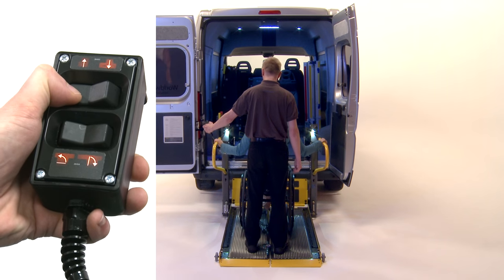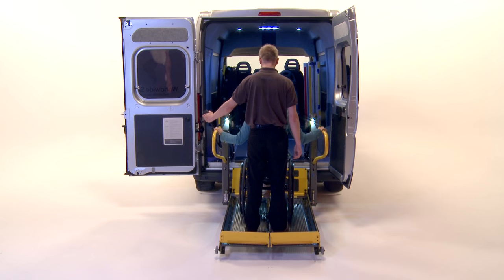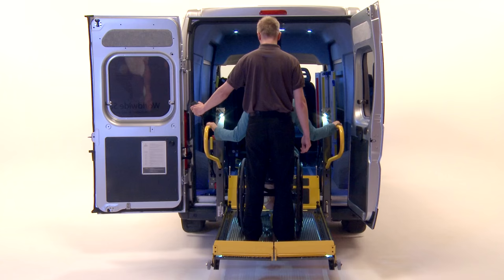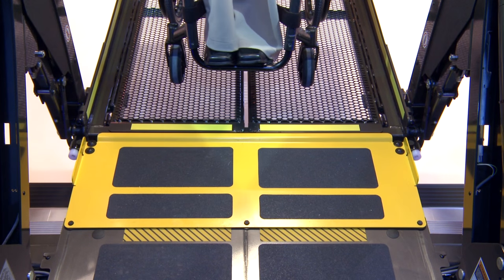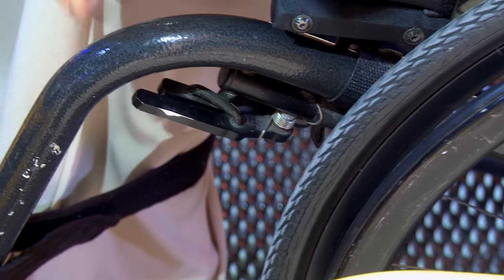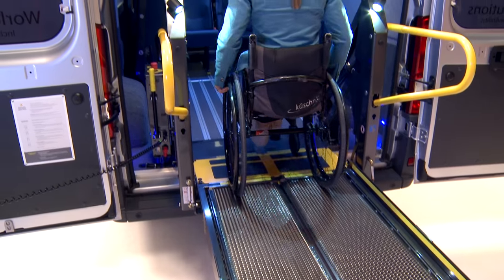Press the raise button on the handheld control to lift the platform to the vehicle floor level and allow the inboard barrier to form a safe bridge into the vehicle. Turn the power on or undo the brakes on the wheelchair and transfer the wheelchair user into the vehicle.